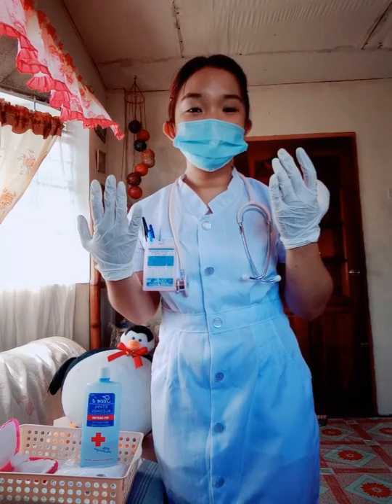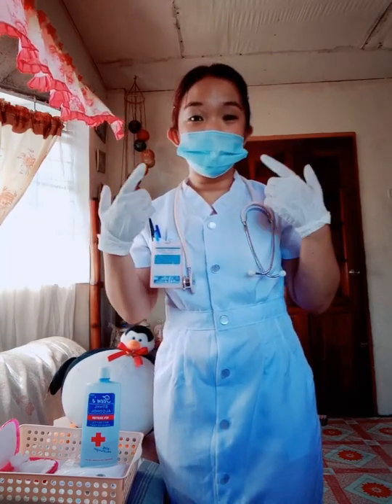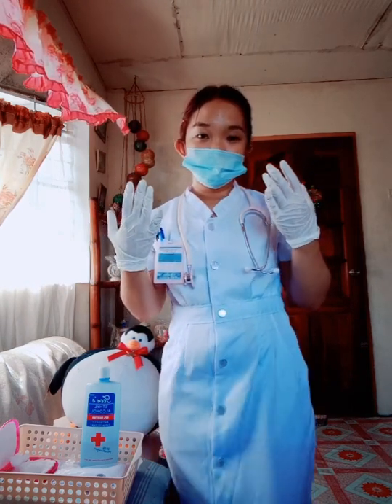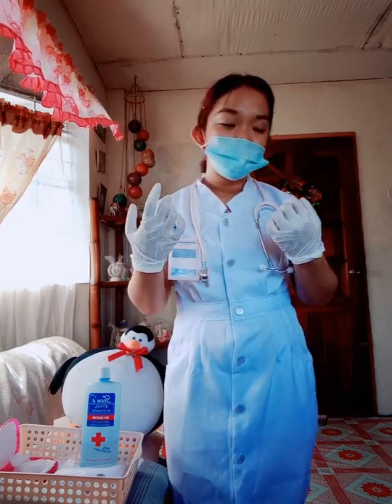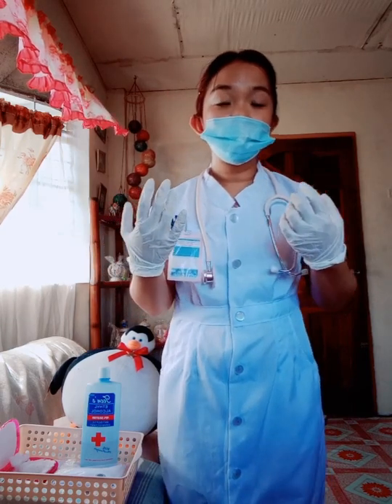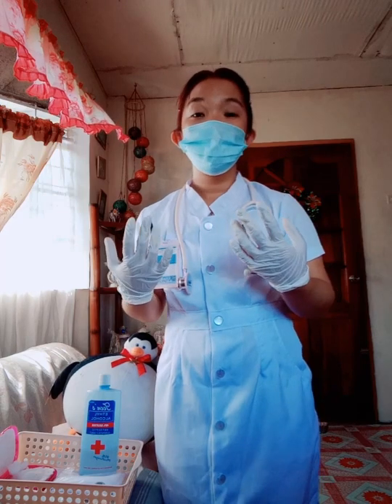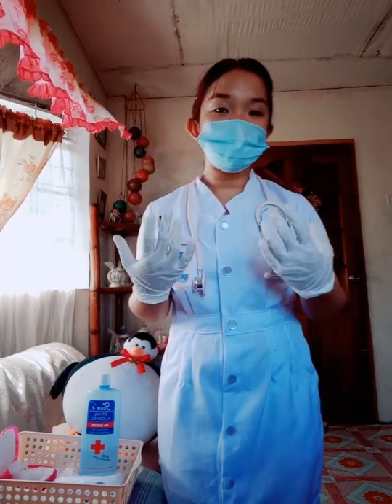After washing our hands, as you can see, I'm now wearing surgical gloves and a face mask, which is also a part of the infection control. So, we can now go to the second step of the procedure, which is to prepare the medication that we're going to use, from the ampule or vial for drug withdrawal.